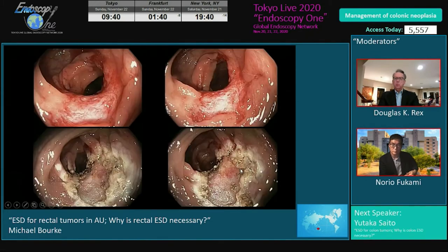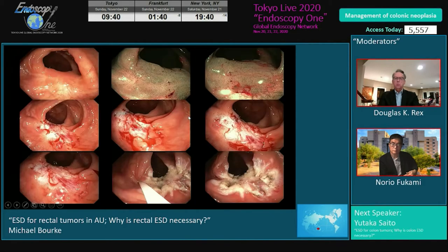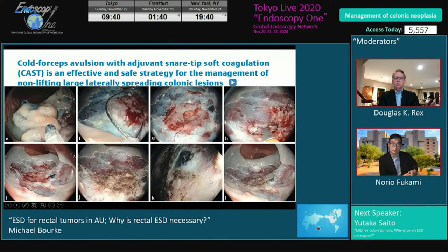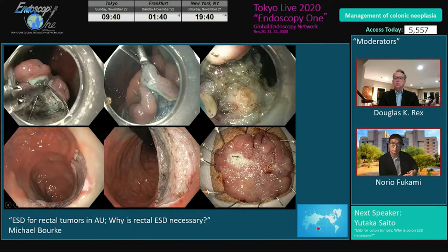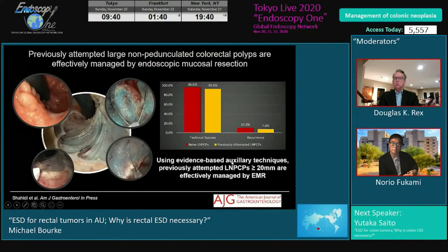Recurrence is easily treated by cold avulsion followed by snare tip coagulation — simply excise the normal tissue around the lesion, proceed to snare tip, then cold avulsion and snare tip in the center, and clip if needed. Very scarred lesions can be treated this way. Previously attempted lesions can also be managed by EMR — I often hear people saying 'it's scarred, it'll have to be done by ESD,' but that's complete nonsense. It can be done by EMR very swiftly and effectively.